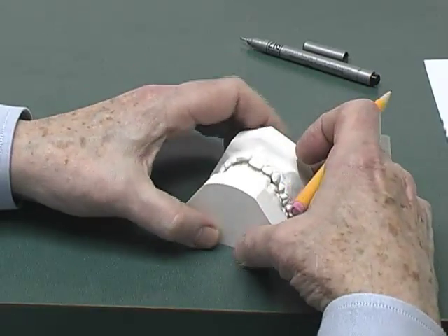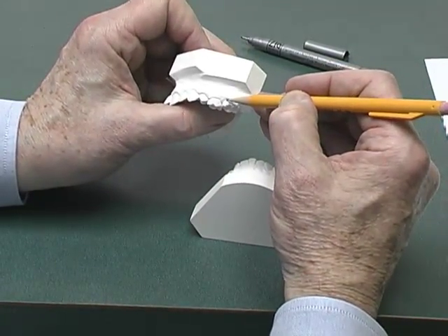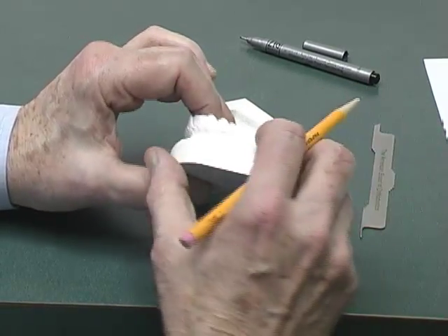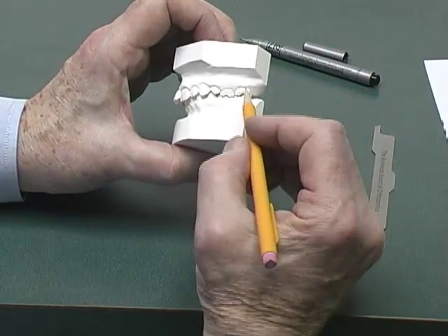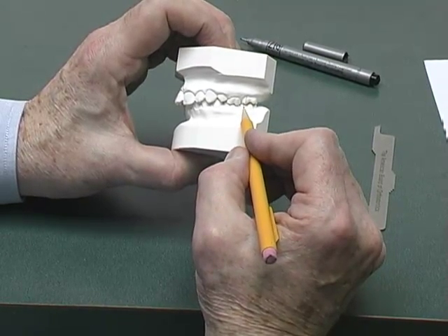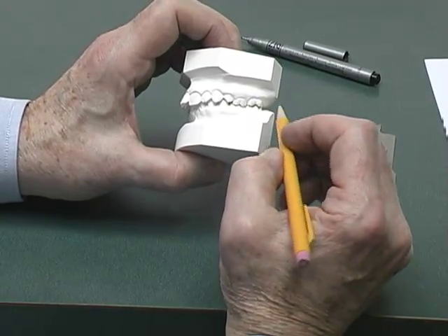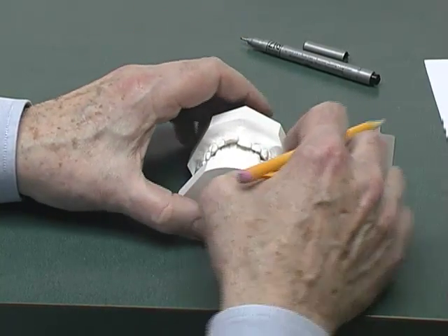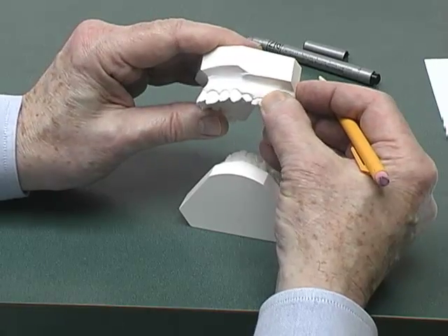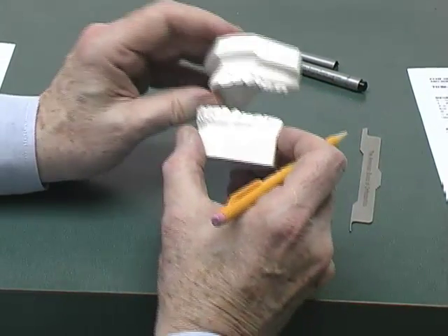Now we will switch to the left side. I'm going to go ahead and mark the lines — the height of contour on the maxillary first molar and the height of contour on the mandibular first molar. When we occlude them, you can see the line on the maxillary first molar is between the buccal groove of the mandibular first molar and the height of contour. Referring back to the instructions, this is not end-to-end, therefore a zero would be recorded for that particular molar. Don't be afraid to use your pencil to mark on your cast — they can be wiped off the soaped models pretty easily.